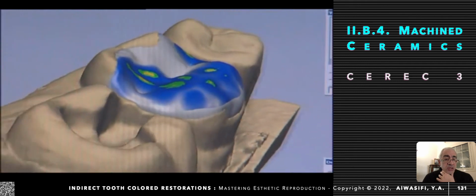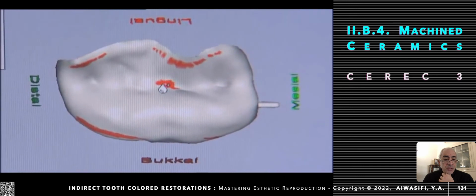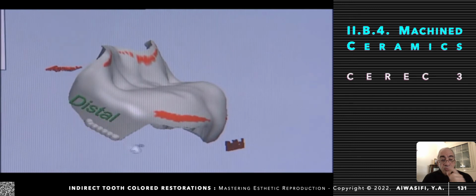He is now rechecking the restoration, okay, removing the restoration from the cavity preparation and rechecking its accuracy, rechecking the fitting surface. I would like you, in the coming scene, to note how accurate the camera is in recording the fine details, even the indentations of your cutting tools that could not be inspected by the naked eye. Okay, you could note it now.